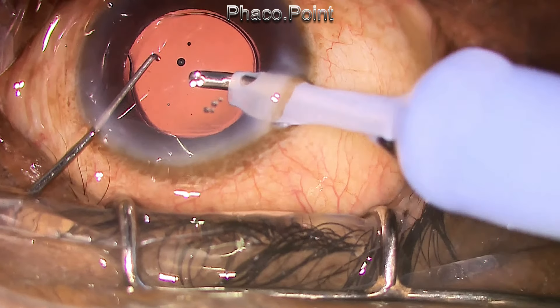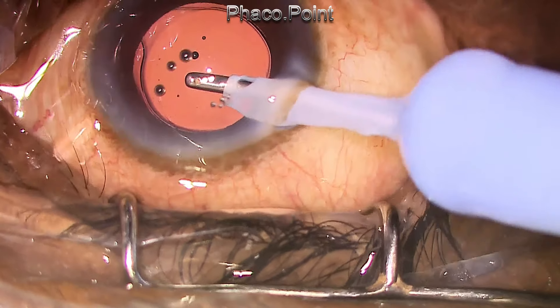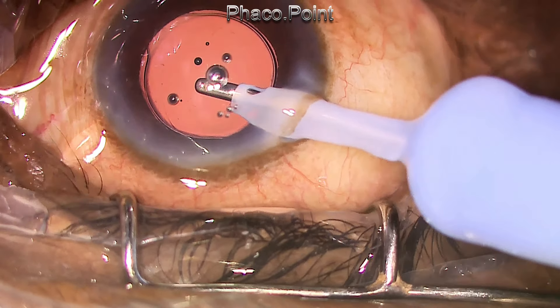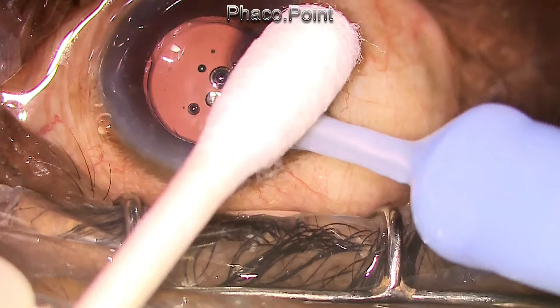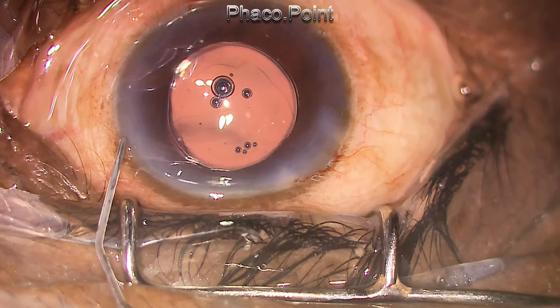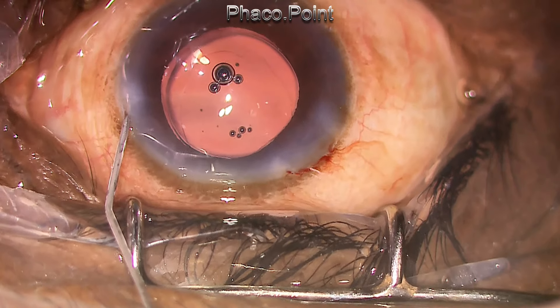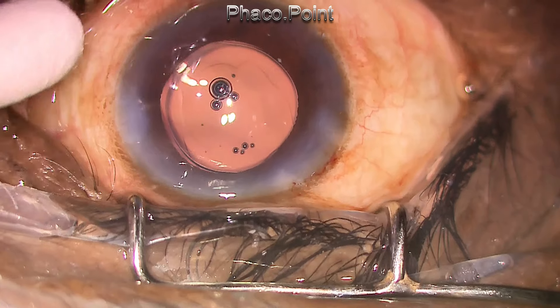Capsular rhexis extension may occur now and then, and many times we have a tendency to convert to SICS, but if you follow these few simple steps you can easily finish phacoemulsification provided your handling is up to a grade 2 nucleosclerotic cataract. I hope this video is helpful to you — thank you for your attention.